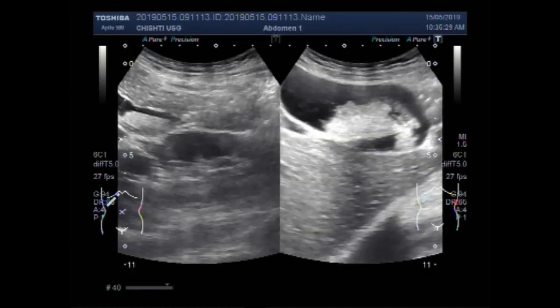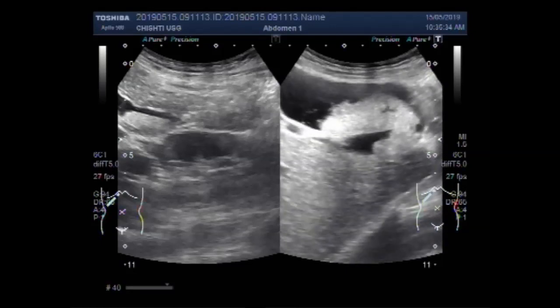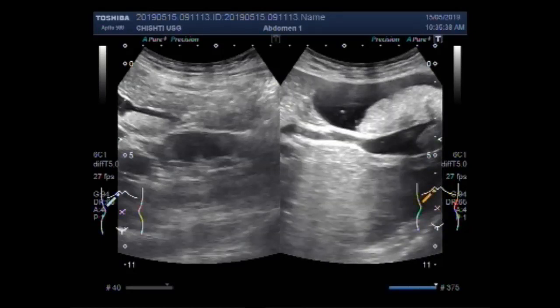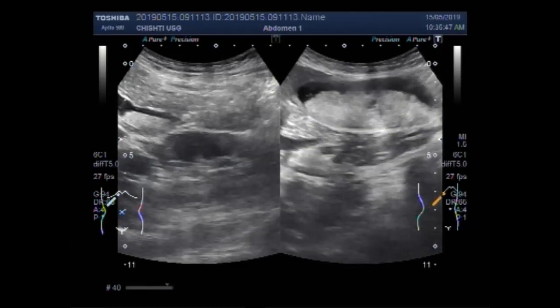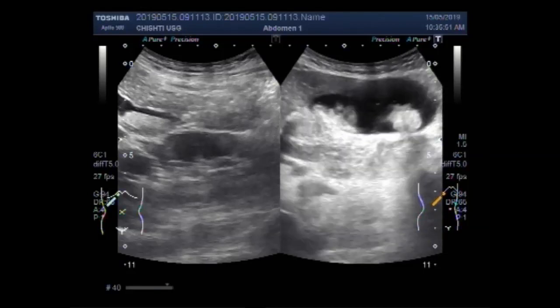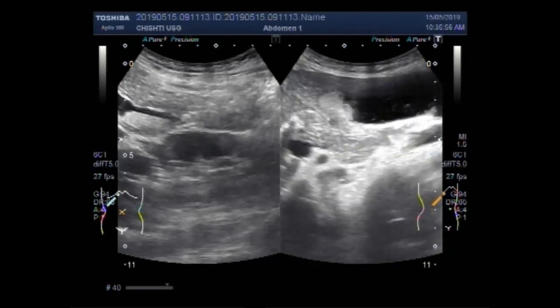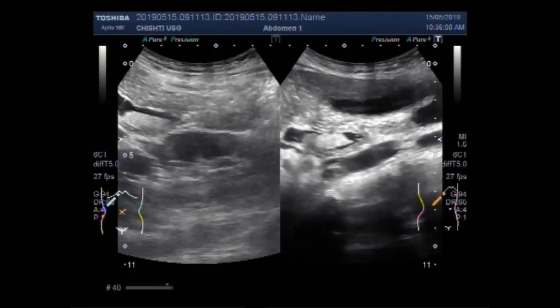Now we put the patient on their side. And again you can see the thick sludge in the gallbladder. Again you can see the stones in the gallbladder sludge.